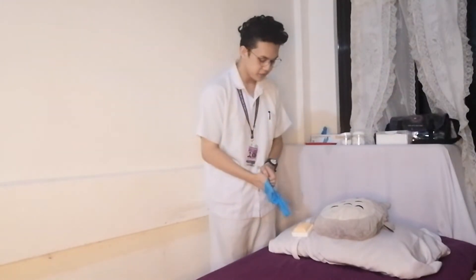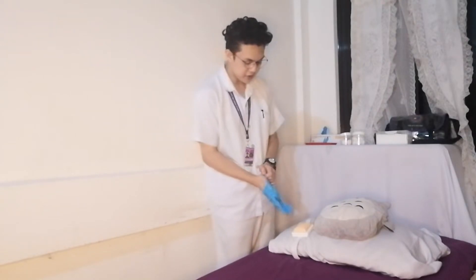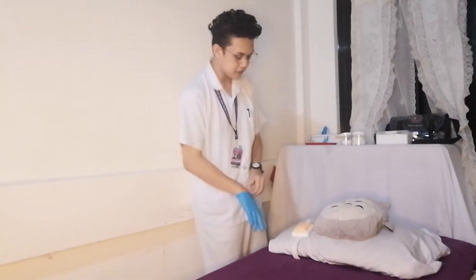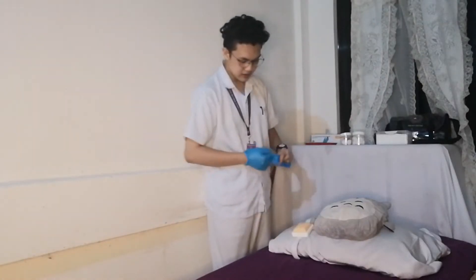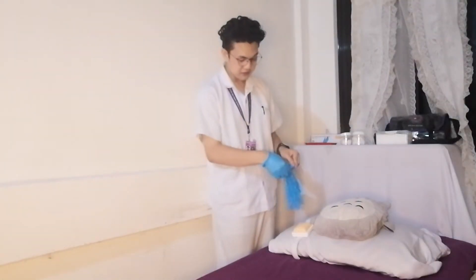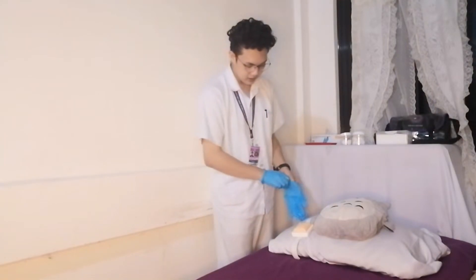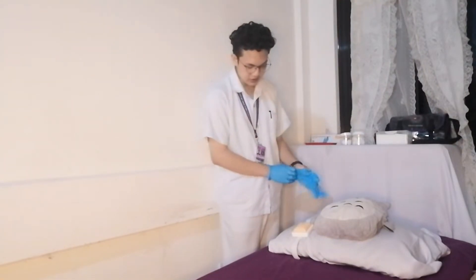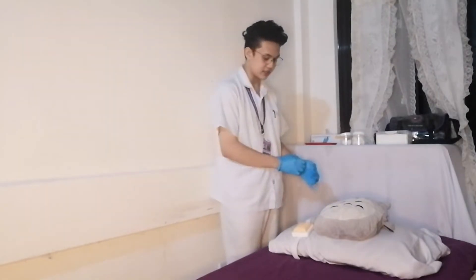I'll be wearing my gloves to prevent cross-contamination between the two of us. I'll be inspecting for the injection site now. May I see your forearm, please? I see that your forearm is free of lesions, and there is no bruising as well.